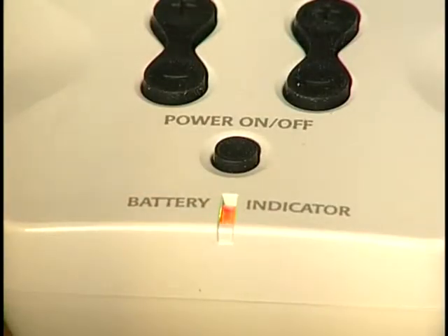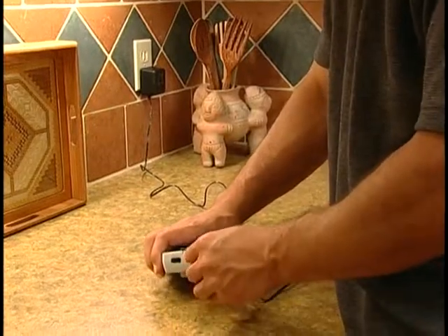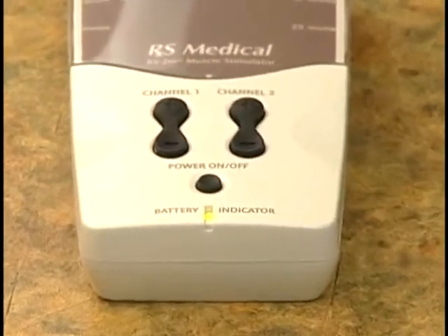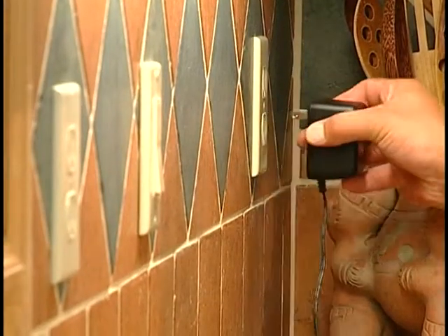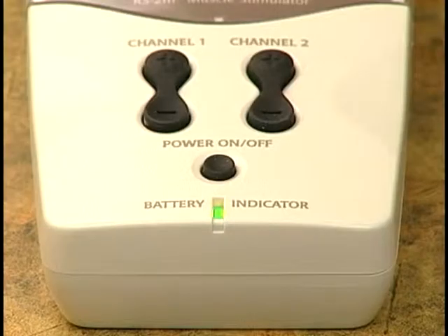It's very important that you recharge the stimulator after each treatment or any time the battery indicator light glows red. To recharge, plug the battery charger into a standard 110-volt electrical outlet. Next, plug the other end of the battery charger into the battery charger jack at the top of the stimulator. The battery indicator light will glow yellow when the stimulator is charging and change to green when it is fully charged. If the battery indicator light does not turn on at all, try another outlet. If the stimulator still won't charge, call a customer service representative at 800-935-7763. Continuously charge the stimulator when not in use — it cannot be overcharged.